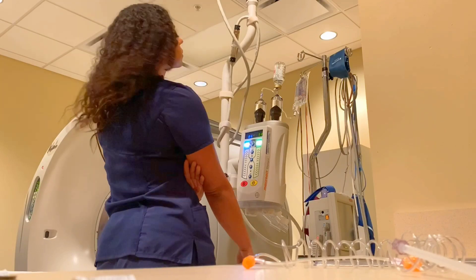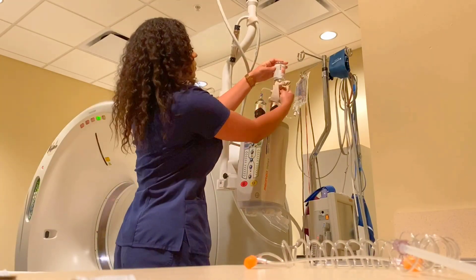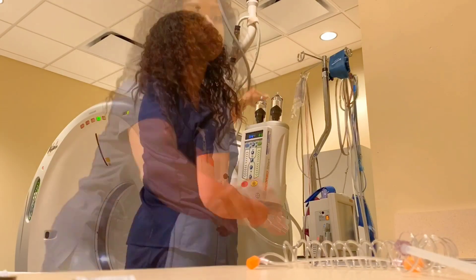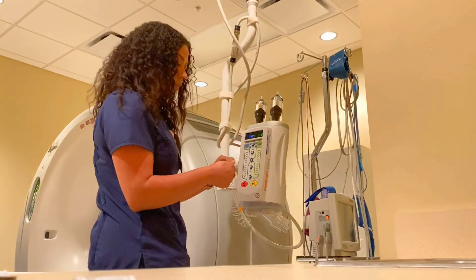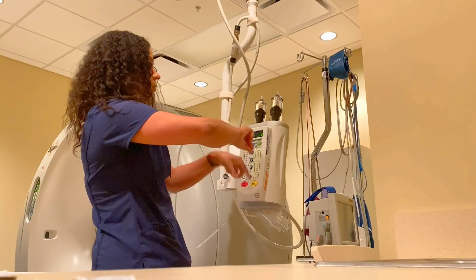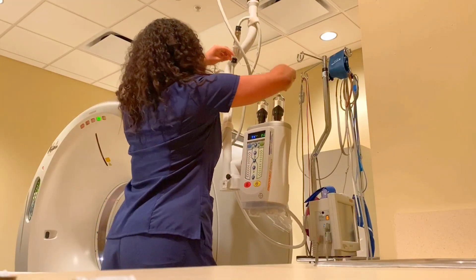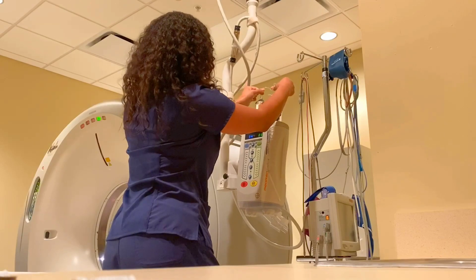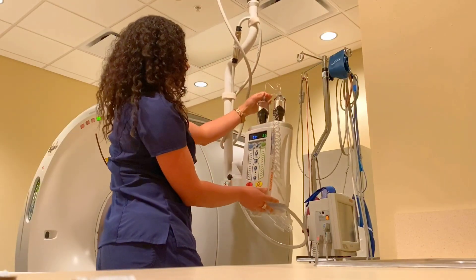Now that it's all done, you'll notice I'm using a paper towel to take that IV contrast off — that's because it's sticky. This is the tubing that will connect from the contrast directly to the patient's IV.